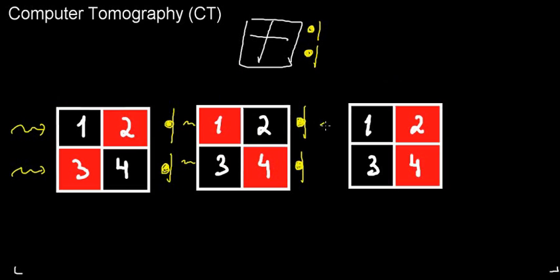Let's see what this square looks like. And I'm going to radiate the x-axis as well, and I'm going to get one attenuation here and one attenuation here. And this basically means all these squares, they look the same to me if I radiate on one axis. Let's see what happens if I add the y component. So I'm going to radiate here, and I can actually detect there is an attenuation here. So let's see. I'm going to have an attenuation somewhere along this line, and I'm going to have an attenuation somewhere along this line as well. It just so happens. There we go.